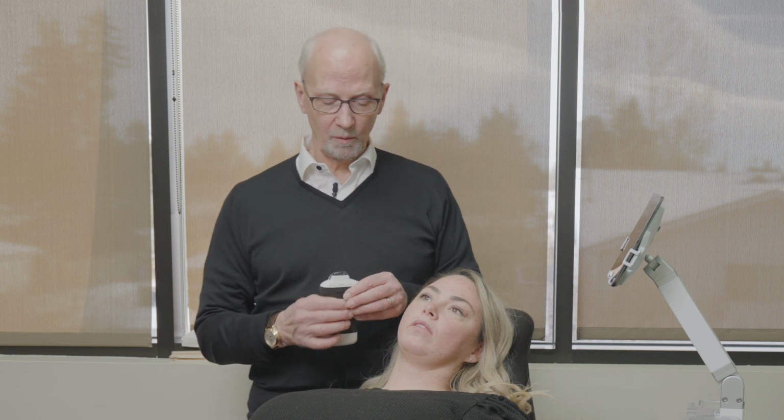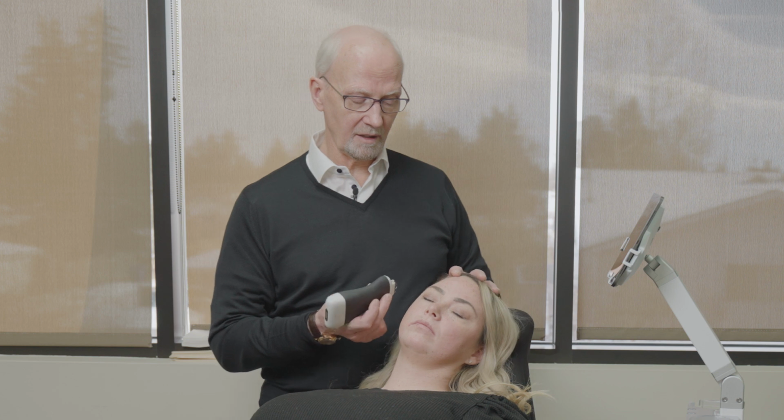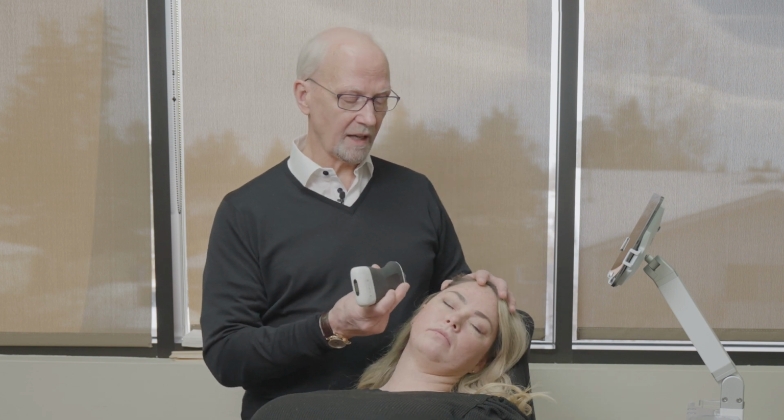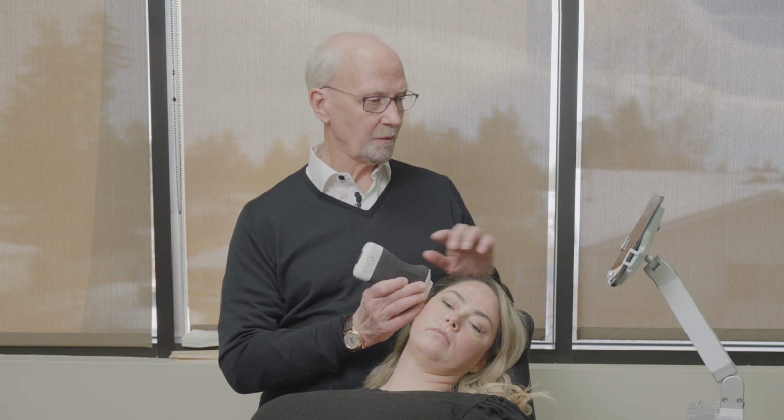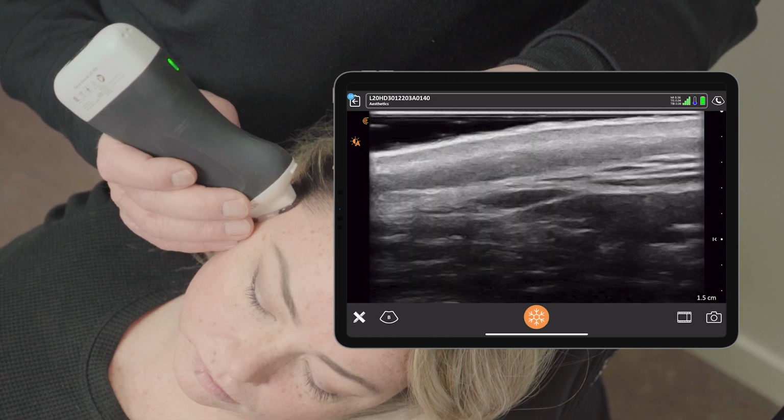So let's take a close look at the temple, really going from the posterior aspect to the anterior aspect. First of all, we'll scan with the B mode, looking at brightness, and then we'll come back looking for vessels. So we've got lots of gel on our device. We're going to orient it. Remember, our little orientation device is at the top because it's vertical. We're going to come into the temple.